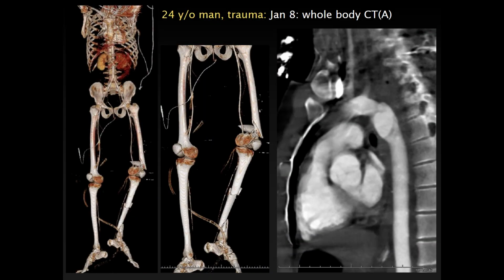So this was one of these unfortunate gentlemen. He had a major trauma, had a whole body CT, he also had head CTs and everything. You can see he had a complex fracture of the femur and tibia, but his most severe, life-threatening lesion, obviously, was that he had an aortic rupture, which you can see here on the sagittal reformations. And aortic ruptures that require treatment do not need to be gated.